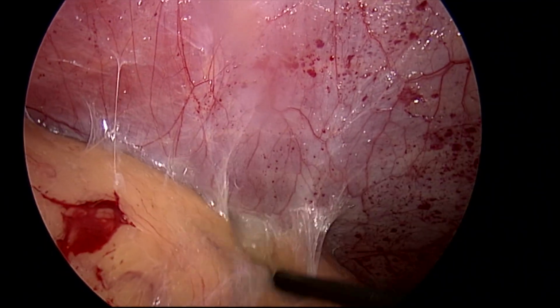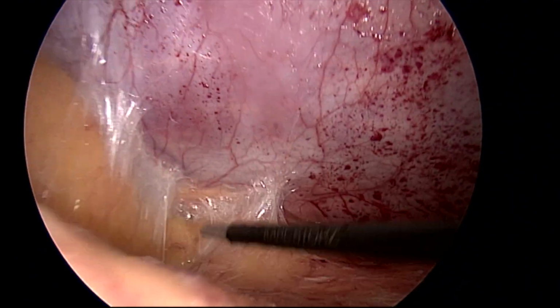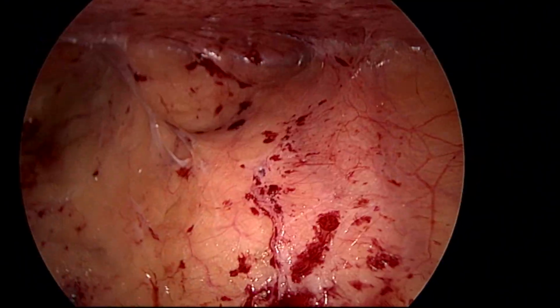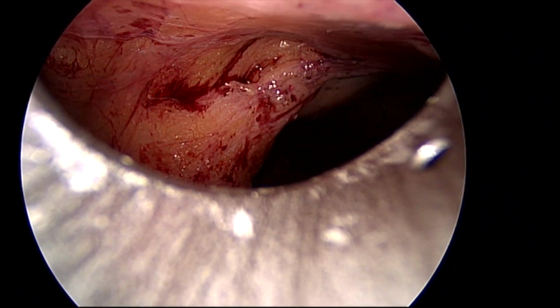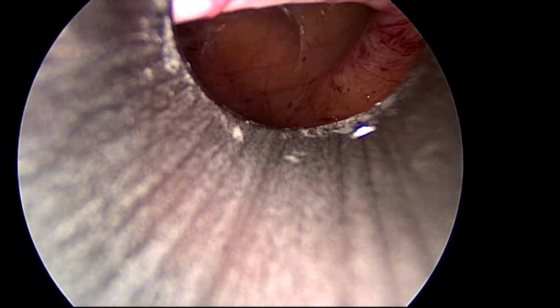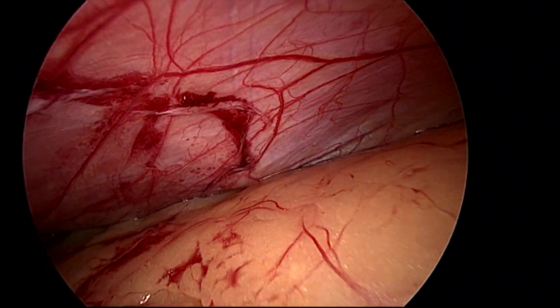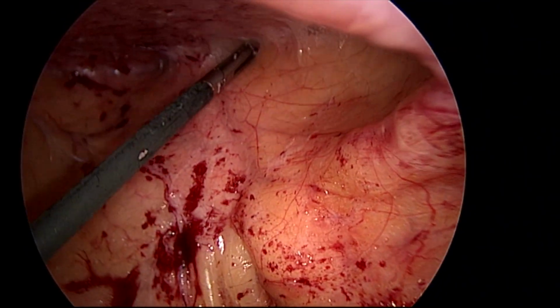It is not a previously operated abdomen, there is no scar in the midline, but because of the inflammatory adhesions, it is very densely adherent to the abdominal wall. So omental adhesion released. Now I am going to make another trocar, at the left lobe of liver, and this one I entered with the optic view trocar, 5 mm on the left side. So now this is the right lateral port I made.